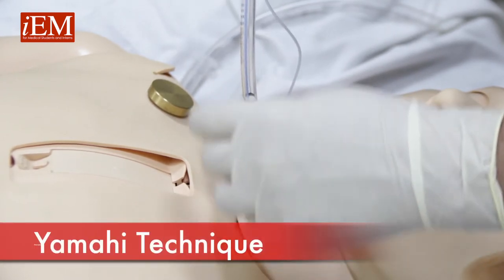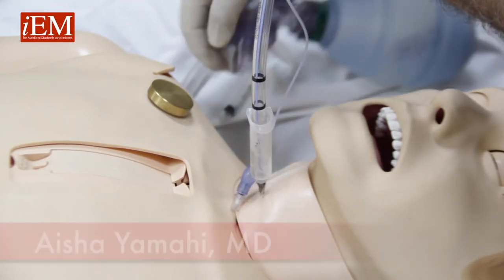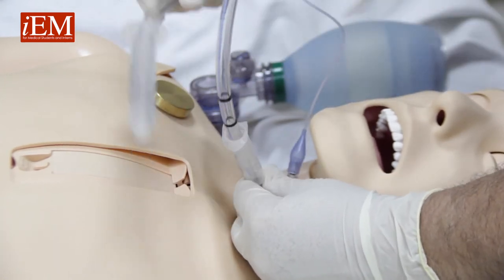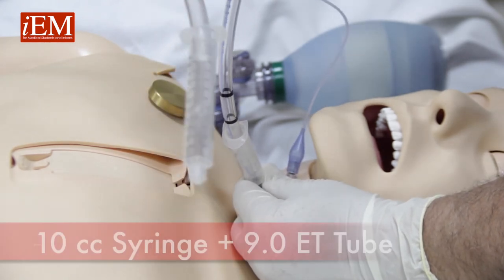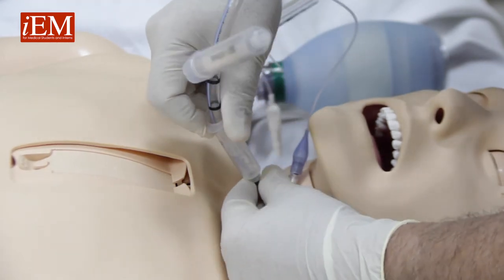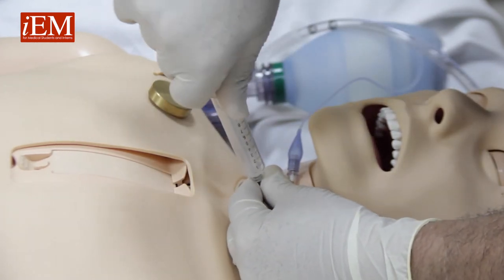And the reason we call it Yamahi, because one of our senior residents actually invented this procedure, which is very smart and very good. And as you can see here, I took a 10 cc syringe and I put inside it a 9 size endotracheal tube. It fits exactly the same. If I remove that and I put it right here, and now we can start bagging.